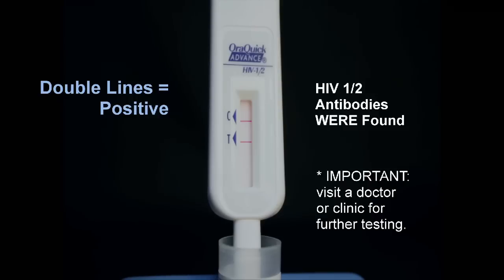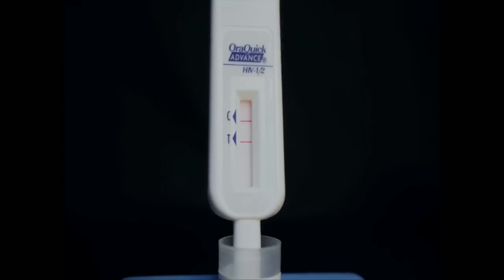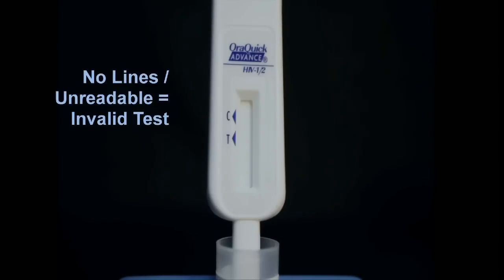A positive test indicates that HIV-1 and/or HIV-2 antibodies were found in the test sample. You should visit a clinic or see a doctor for further testing. It is imperative that a positive test result be followed by a Western blot or PCR test performed by a doctor or clinic to confirm if you are indeed HIV positive. If no lines appear or the result is difficult to read, the test is invalid. You should test again with a new kit.